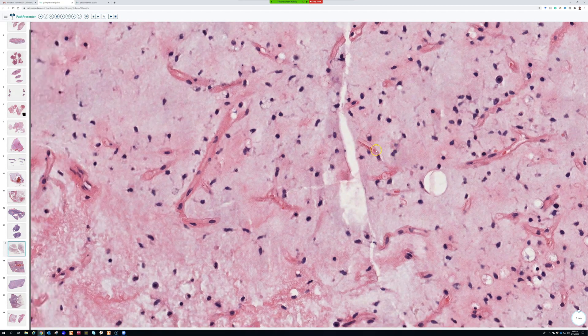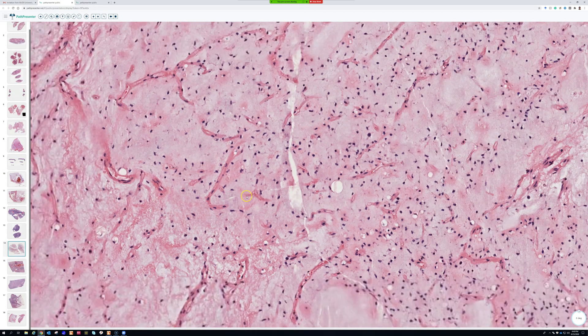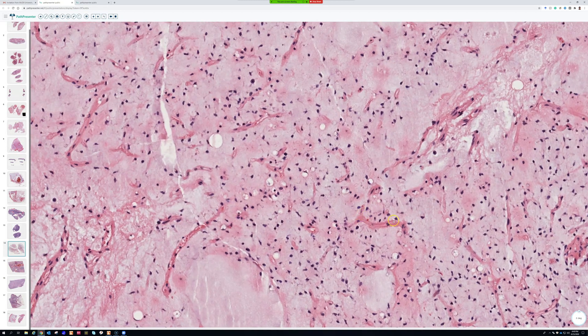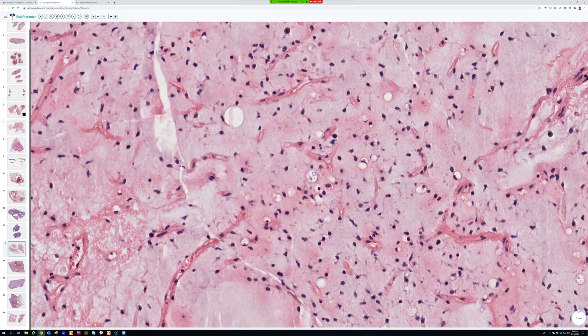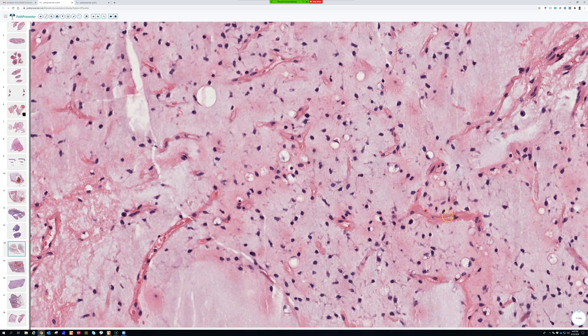If you're seeing vessels that are branchy but have a muscle layer and pericytes around the outside of the endothelium, that's not the vessel pattern for myxoid liposarcoma. You want these super delicate vessels — look at how tiny those red cells are. The pattern is often called 'chicken wire,' but I don't really like that terminology since chicken wire is perfect repeating hexagons of metal. I prefer 'delicate branching vessels' or 'chicken scratch vessels.'